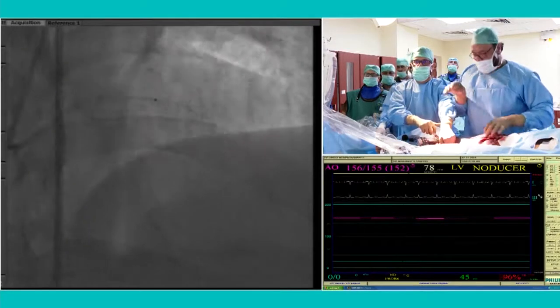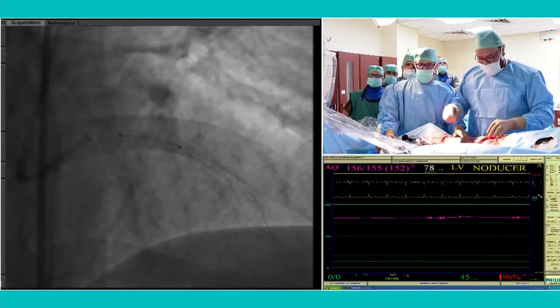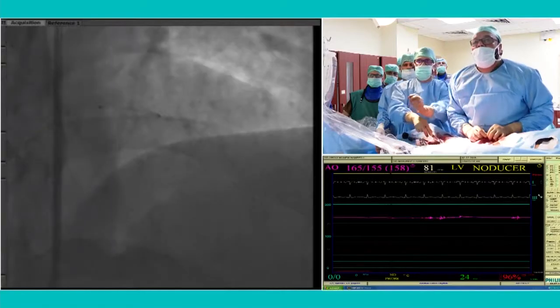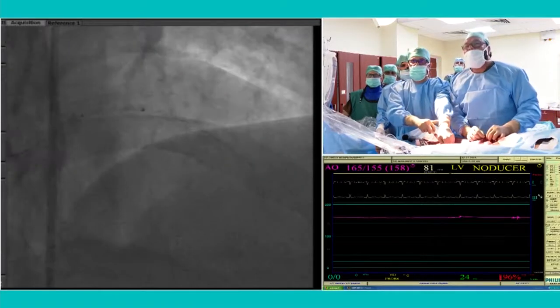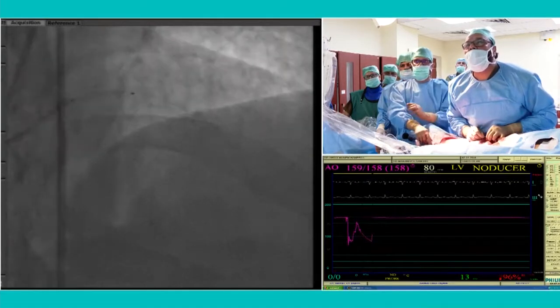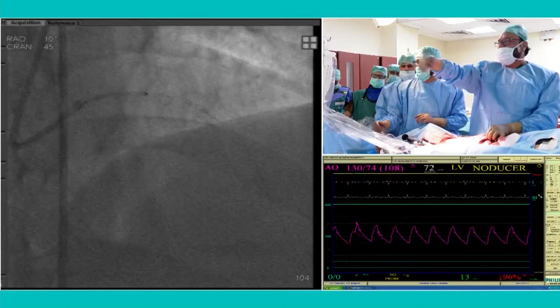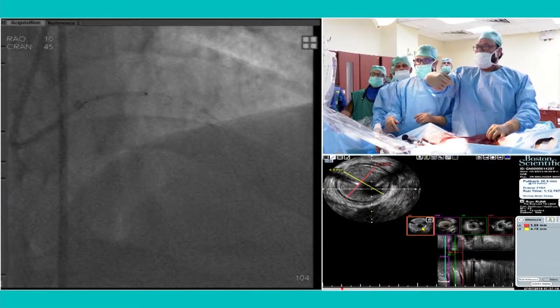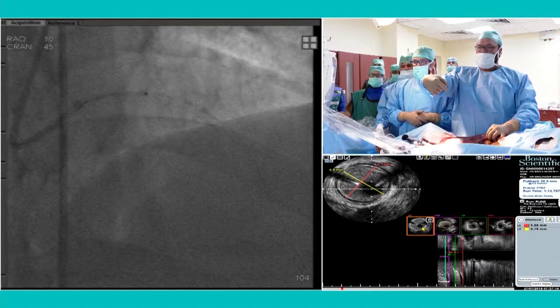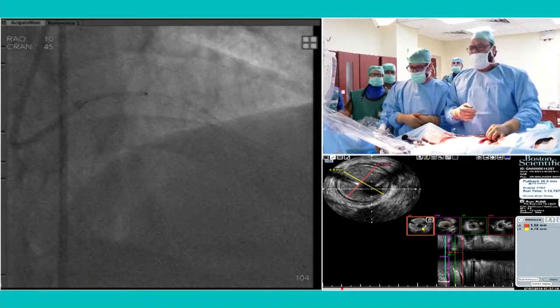No, we had done the IVUS of the left main body, and I was in the ostium. You have seen the LMCA was totally free of disease. Yeah, the LMCA body onwards. Can you show the LMCA body, this IVUS image on screen, please? You can see that there's no disease in the left main beyond the mid part of the body.